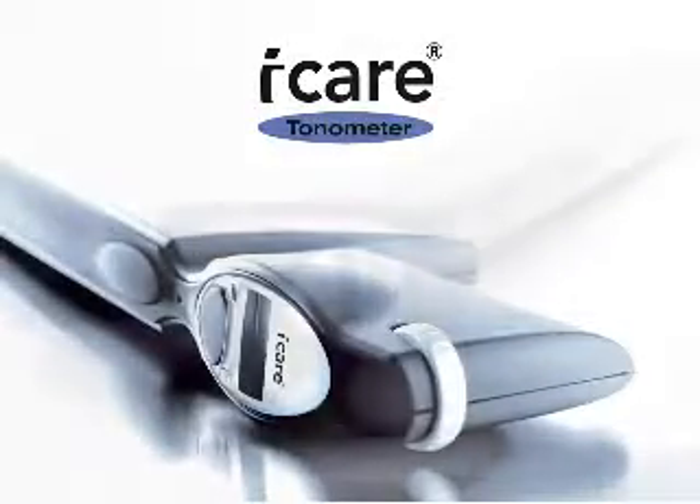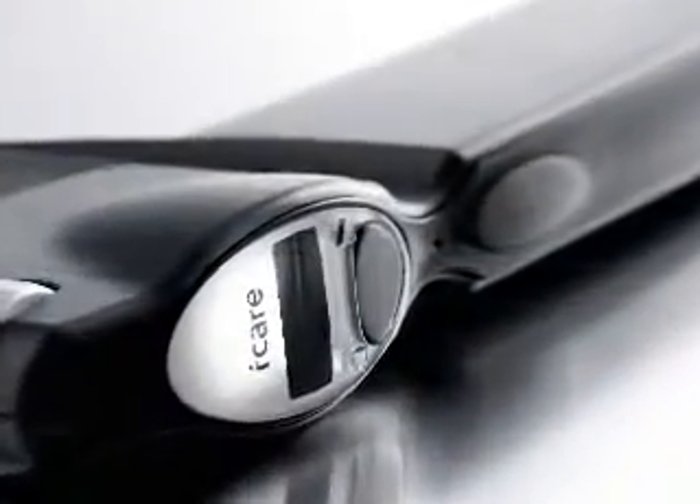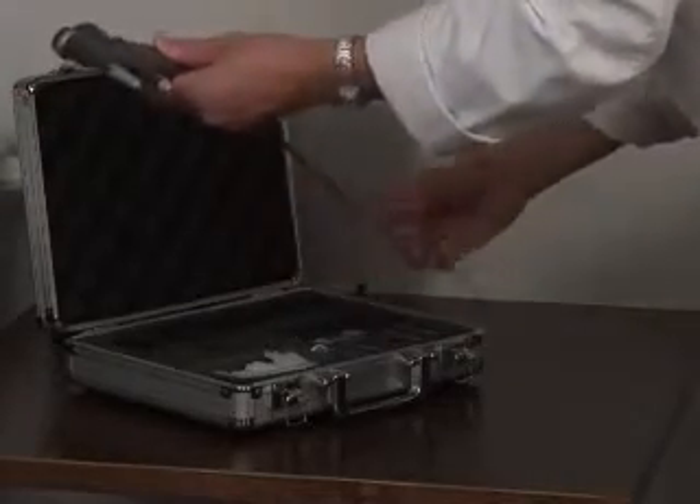The iCare Tonometer is a new wave technological solution for measuring intraocular pressure. The device is small, handheld, and portable — a giant leap away from the traditional IOP measuring device.